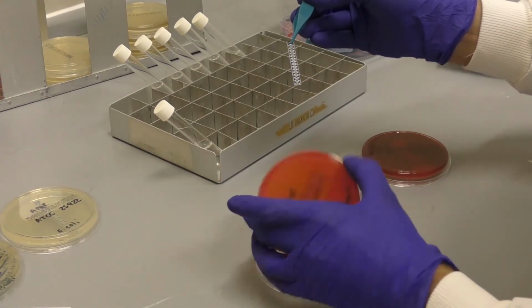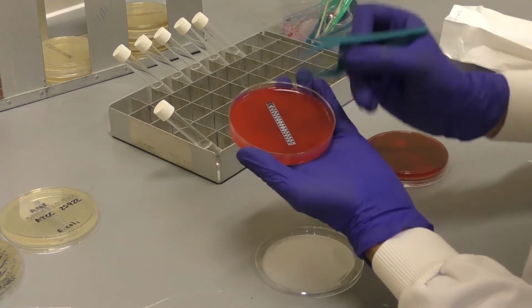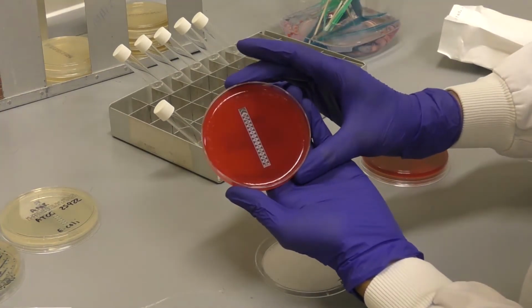Do not place the strip upside down, as no inhibition ellipse will form, since the antibiotic will not diffuse across the non-porous plastic strip. If air pockets are seen under the strip, remove them by pressing gently on the strip without moving it with the applicator tip or forceps, working from the lowest concentration upwards. Small bubbles will not affect the results. Once applied, however, the strip cannot be moved because of the instantaneous release of antibiotic into the agar.